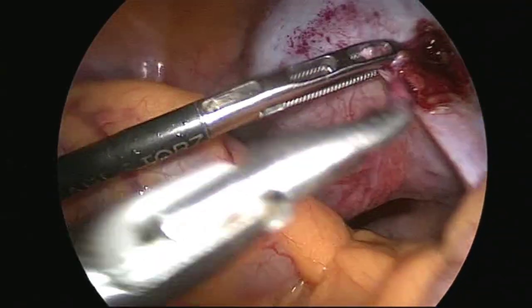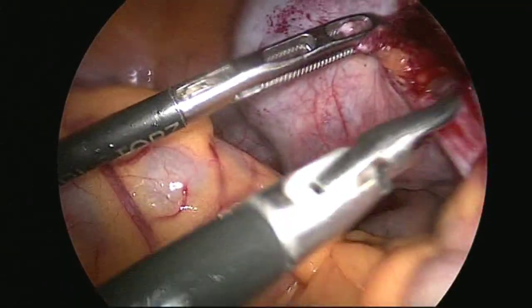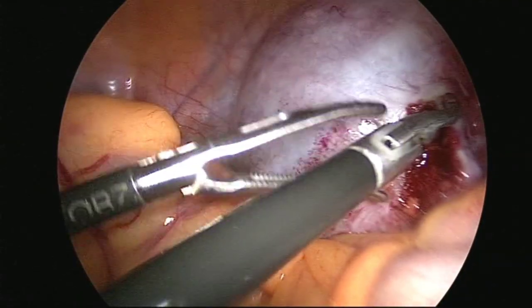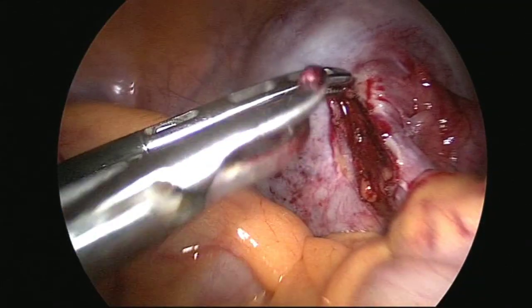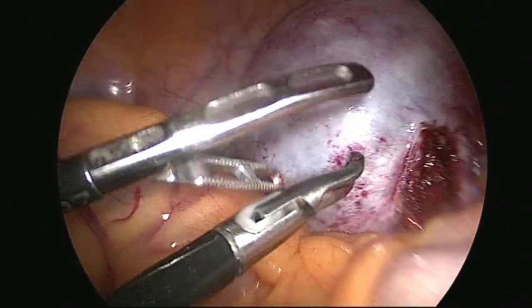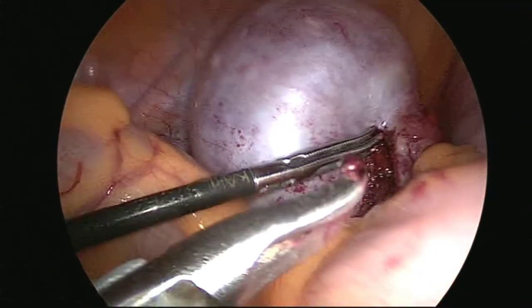Bleeding is controlled. Now I will extend this incision, and meanwhile I have to protect the fallopian tube also, because in future this patient is going for natural pregnancy.